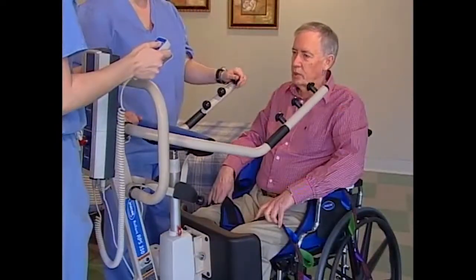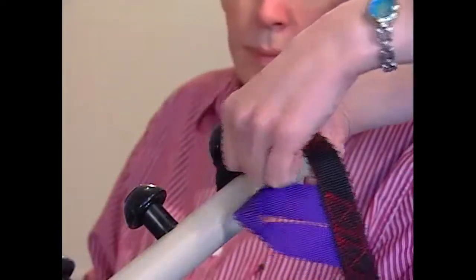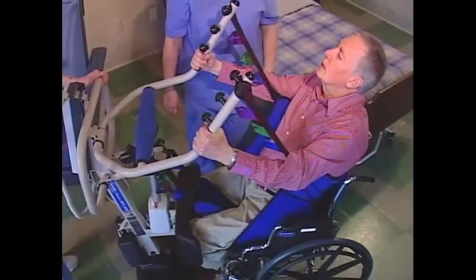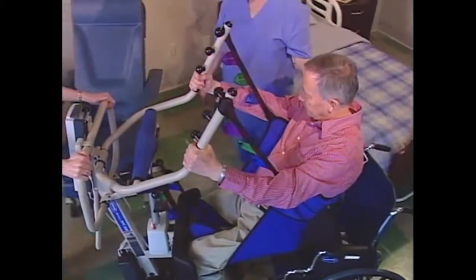Although one lift will work for most residents and multiple hookup points adjust for different body sizes, it's recommended that each resident be issued their own individual sling that conforms to their weight, medical condition, and type of transfer to be performed.